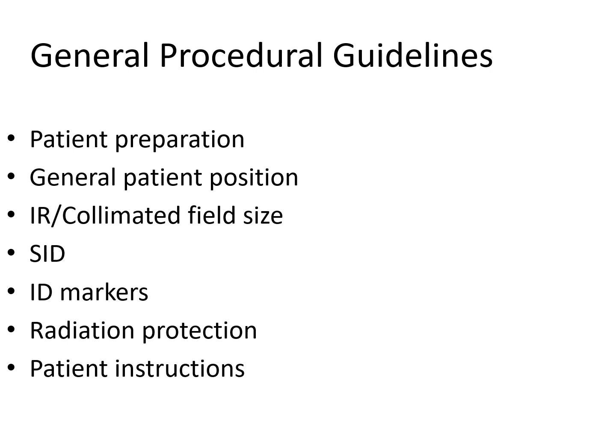IR collimated field size, 10 by 12 is sufficient for all cervical projections, including the swimmers. What? Yeah, 10 by 12, you heard me. SID is specialized for the lateral cervical spine. We want to use 72-inch SID. I don't know why that doesn't carry over to the swimmer's projection. Swimmer's projection is recommended at 40. All other views recommended at 40.